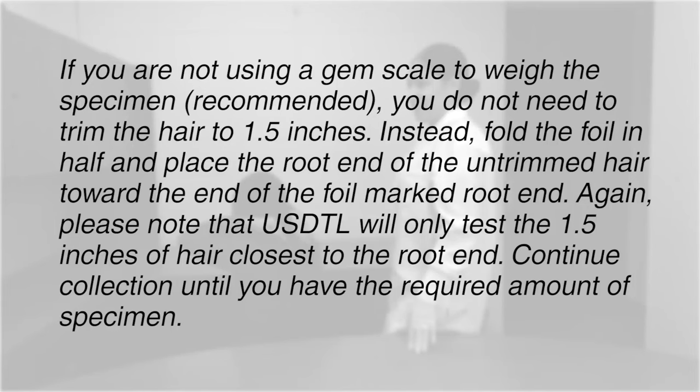If you are not using a gem scale to weigh the specimen, you do not need to trim the hair to 1½ inches. Instead, fold the foil in half and place the root end of the untrimmed hair toward the end of the foil marked root end. Please note that USDTL will only test the 1½ inches of hair closest to the root end. Continue collection until you have the required amount of specimen.